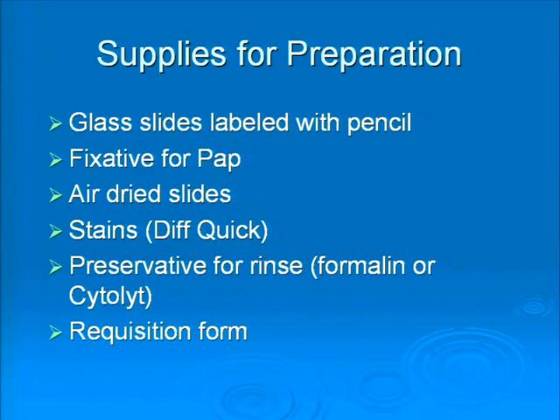Most places will use some sort of a rinse. Right now, many of them are alcohol or formalin-based. Many places are switching over to more of a molecular-friendly fluid for your rinse, so that as we progress through this era or dilemma of molecular, we can decide which nodules we want to reflex or send testing off for. And then your requisition form.